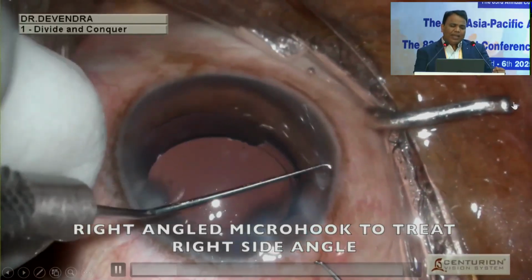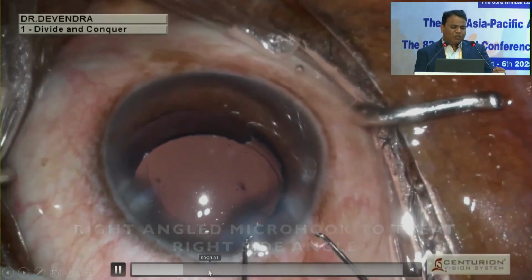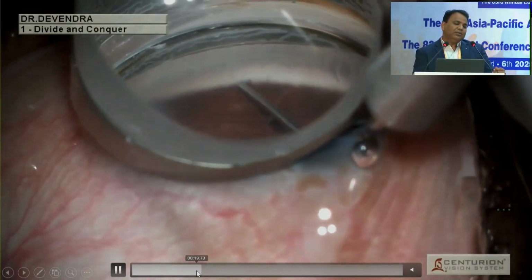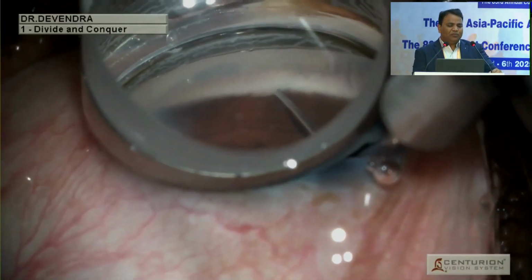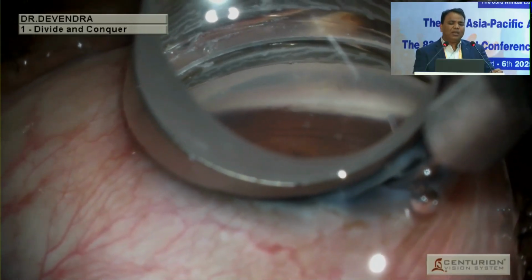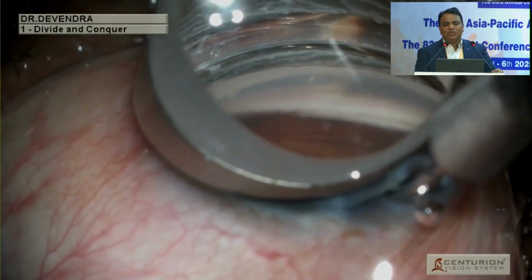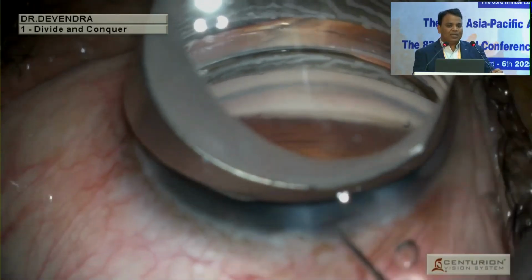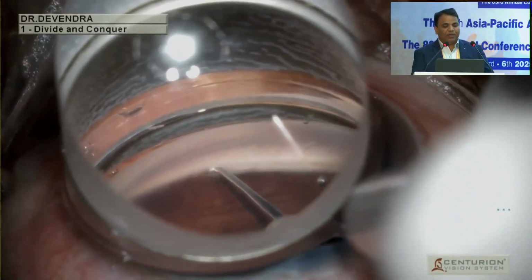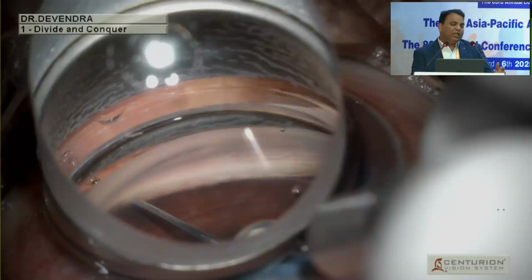Like any other surgical procedure for MIGS, first of all you inflate your anterior chamber with high density viscoelastic, and this Tanito microhook is introduced into the TM, and you can nicely incise it. Once you incise, you can see the posterior wall of Schlemm's canal. You can complete inferiorly or superiorly, whatever you want to start with.